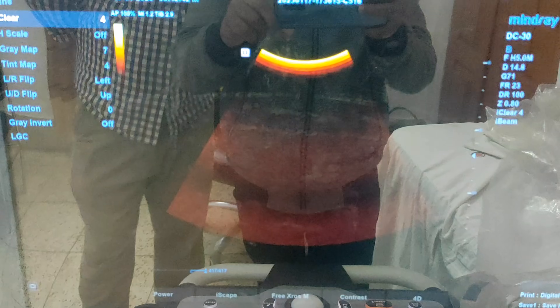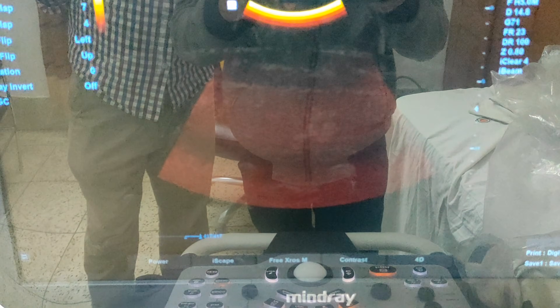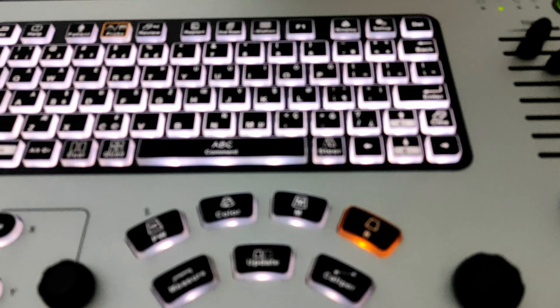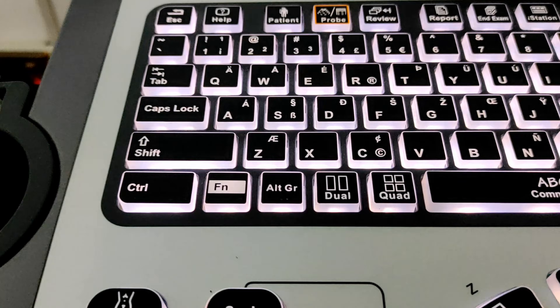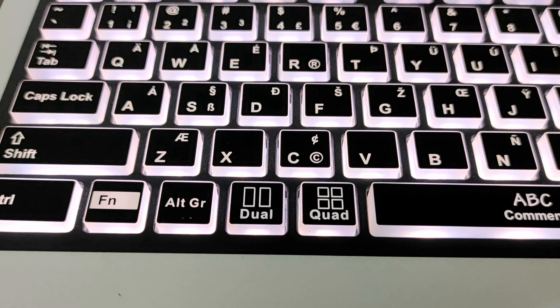Our screen is now on single mode or B-mode. Here is our B-mode button — if you press it your screen will go to single picture mode. For dual picture, here is our dual button, and here is our quad button for four pictures. If I press the dual button, two pictures will be seen on the screen. If I press the quad button, our screen will show four images.